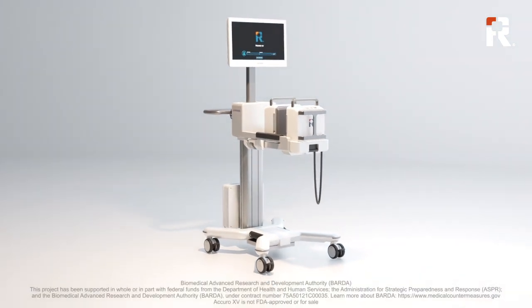Is this accurate as compared to X-ray, as compared to standard of care, as compared to physical exam? And so that will be the next phase once we're happy that the device we have is functioning to the best that it can and does do the main missions of acquiring the anatomy, displaying the anatomy accurately, and again, different operators able to get these images.